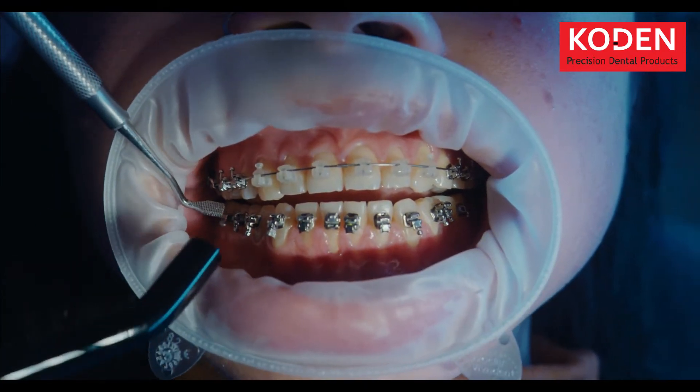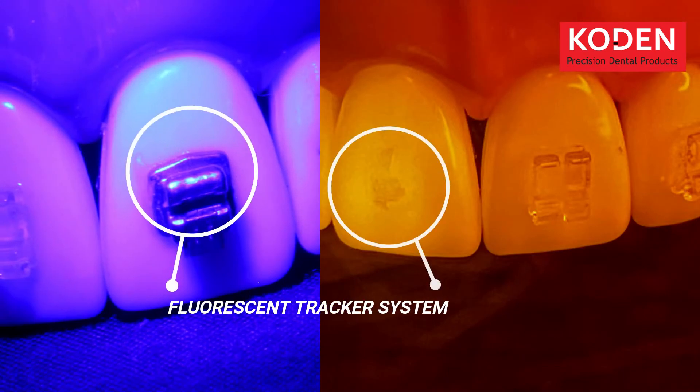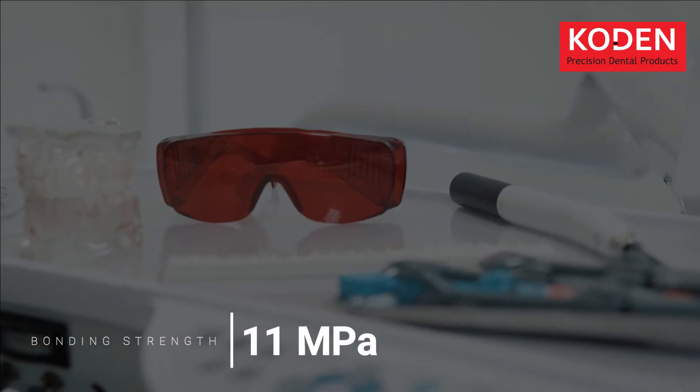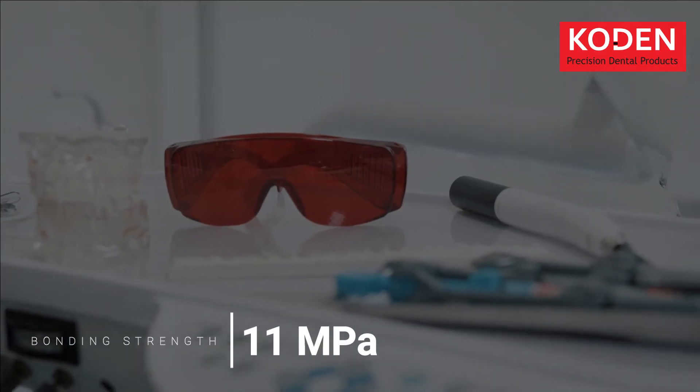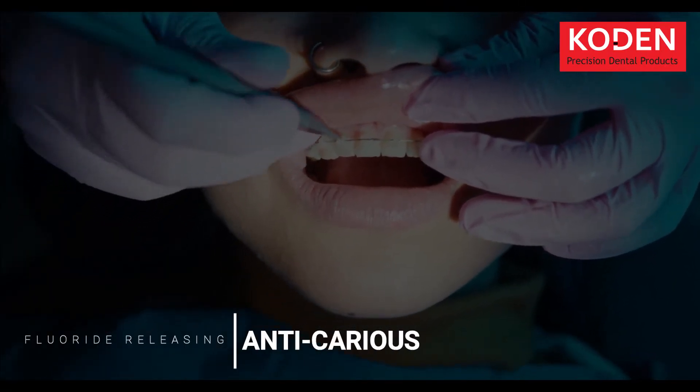Easy Bond is engineered with a fluorescent tracker which separates it from the enamel on emission with UV light. This intelligent tracker system ensures tidy bonding and spotless appearance, providing bonding strength up to 11 megapascals. It also contains fluoride that makes it anticarious.